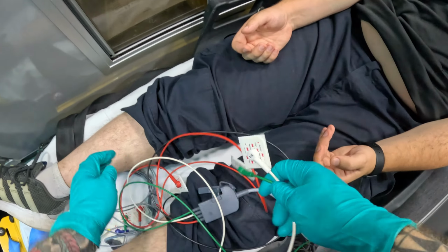And what I want to do is draw a straight line. The next lead you're going to employ is V4, and V4 is going to go on the mid-clavicular line. So move this hand for a second. The clavicle is this bone here. We're going to go mid-clavicular, so in the middle of the clavicle, fifth intercostal space. Right there, that's V4.